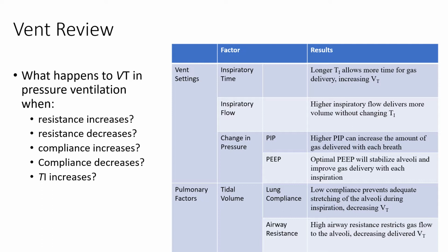Inspiratory flow, a higher inspiratory flow is going to deliver more volume without changing the I time. Typically, if we're going to increase flow, it's usually for patient comfort. So they're getting that breath faster. They're not sucking so hard.